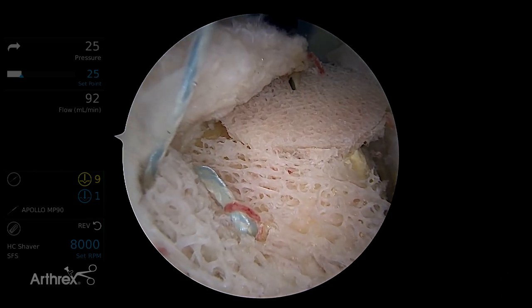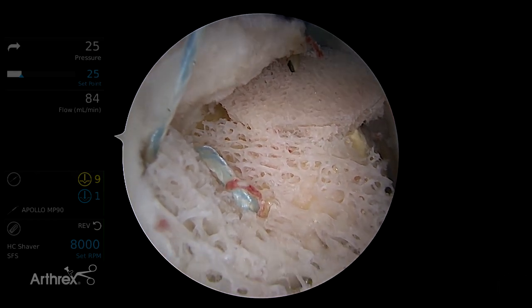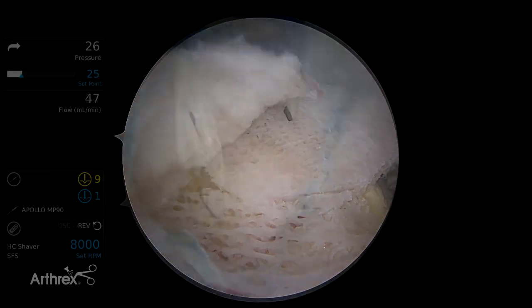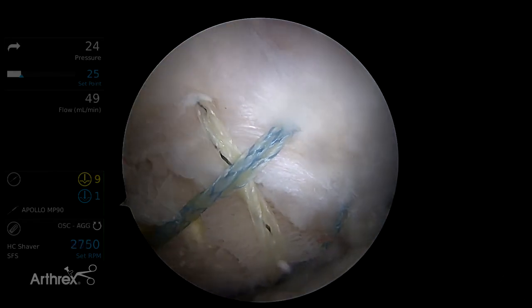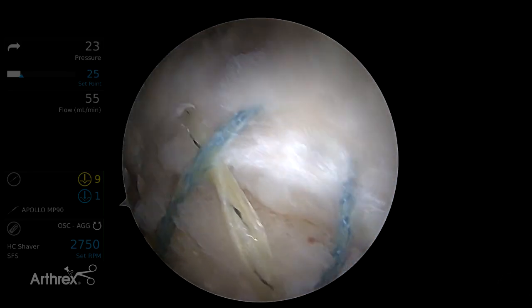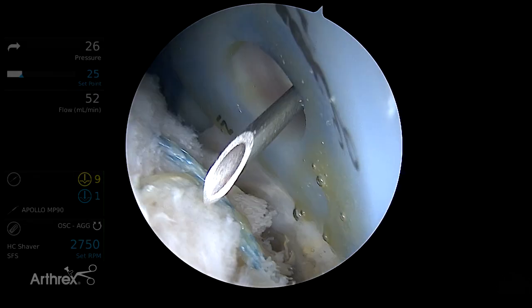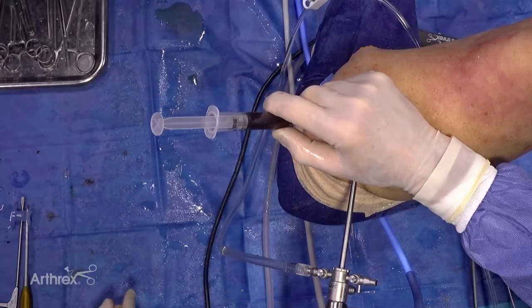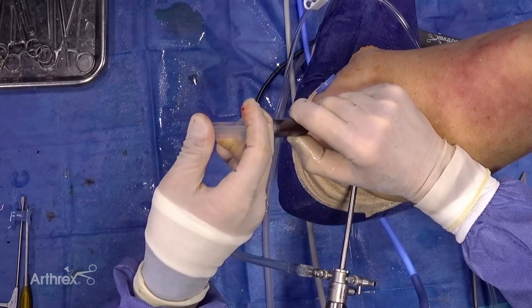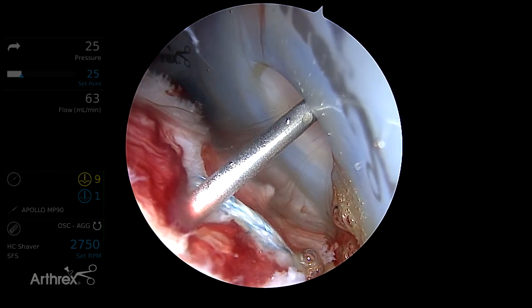Remember, even though it looks as if the BMC is washed out, Dr. Mazzocca has shown us that the stem cells are still there. We've got complete coverage of the footprint, and we're going to bring the cuff repair sutures over the top for compression — good reduction of tissue over the interpositional graft. At the end of the procedure, you can reload the interpositional graft with additional stem cells using leftover BMC, adding additional growth factors to the patch.